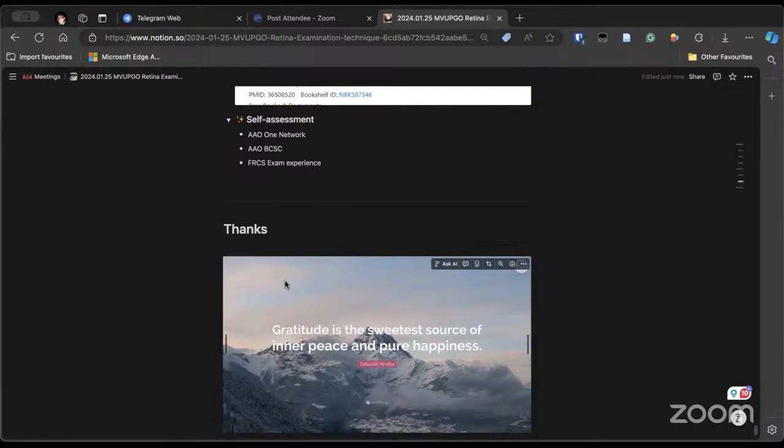Can you explain once more how to look for the posterior vitreous cells? For posterior vitreous cells, you'll have to look with the 90D. You keep the slit and you focus on the lesion. Usually it is seen in retinitis cases. When there is retinitis or chorioretinitis, you focus on the retinitis lesion, and you will be able to see white cells in front of the retina itself. These are more prominently seen on OCT.